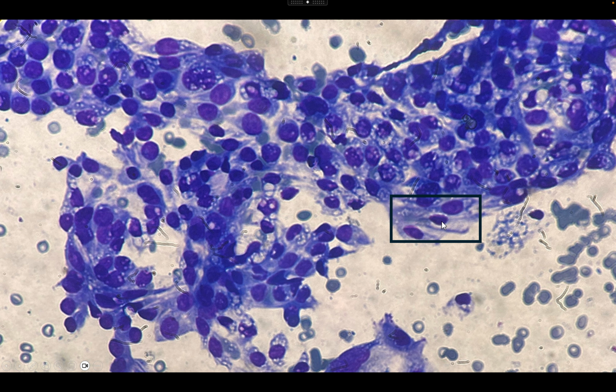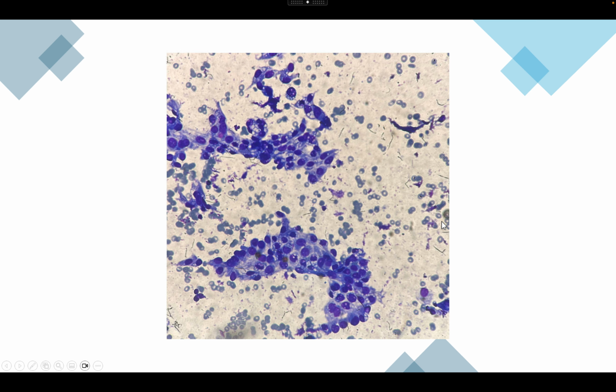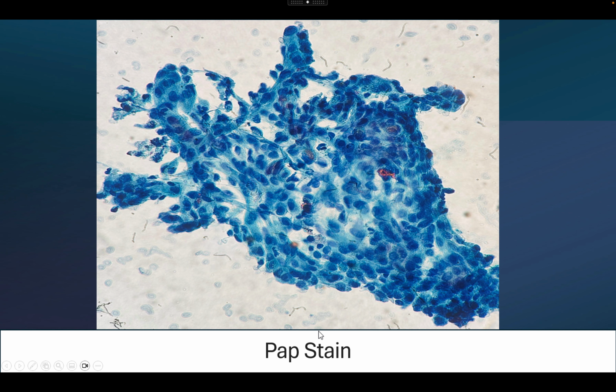And here, demonstrating the cyst lining cells, or they look like cyst lining cells. In this view, we appreciated how it looked kind of hobnailing, as you can see here, with this comet tail appearance. This is the Pap stain to better visualize nuclear detail. We didn't see really papillary structures, which we were thinking of because he has a thyroid lesion. Could this be a met?